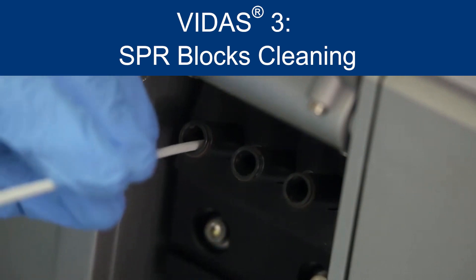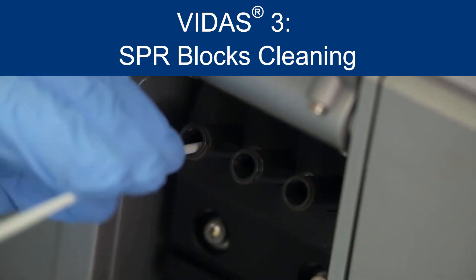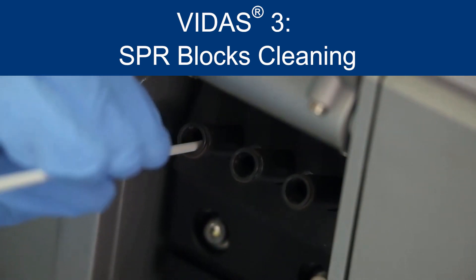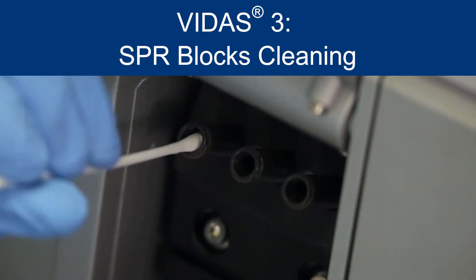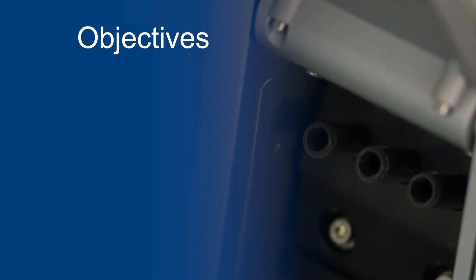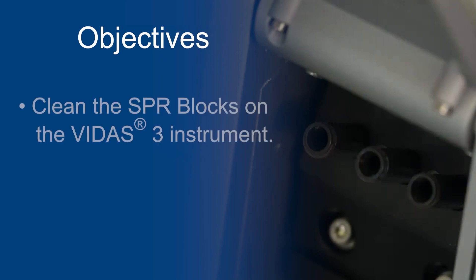The purpose of this video is to demonstrate how to clean the spur blocks during monthly maintenance. At the end of this video, you will be able to clean the spur blocks on the Vitus III instrument.